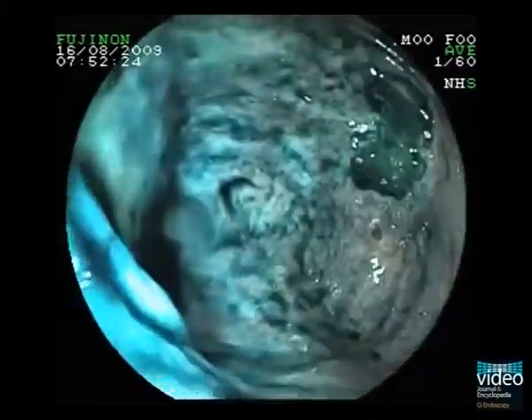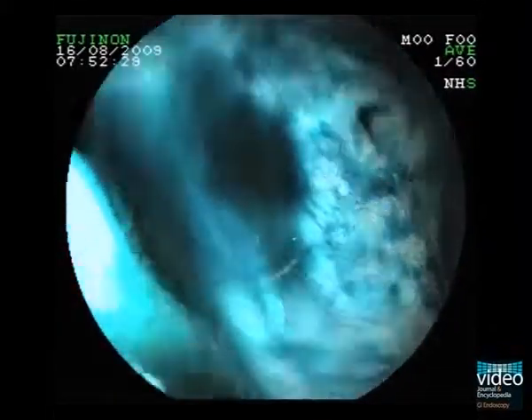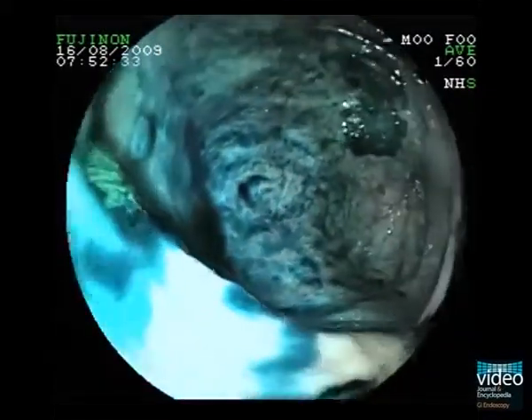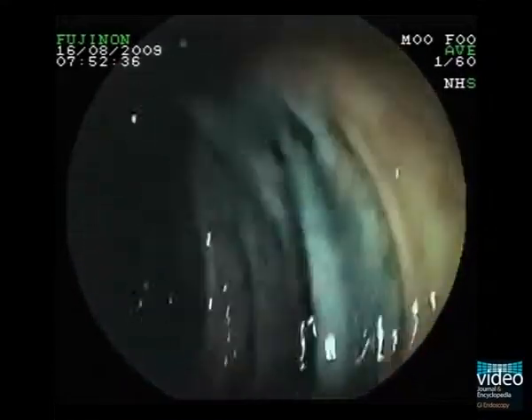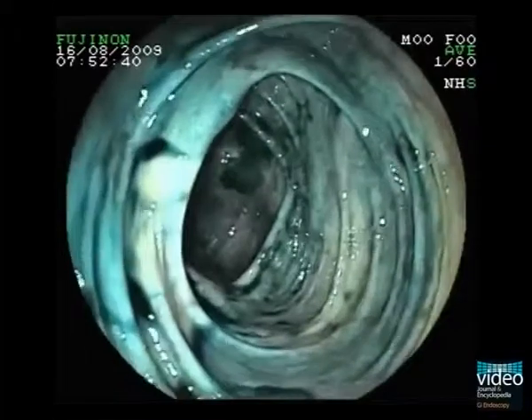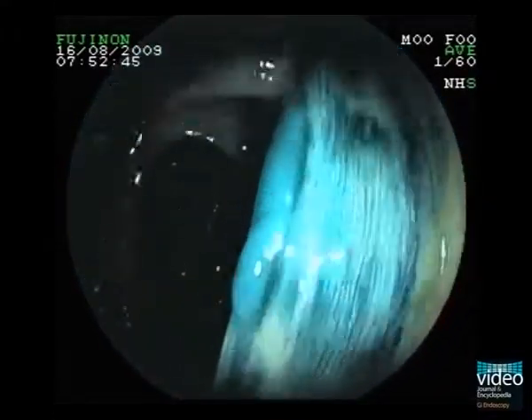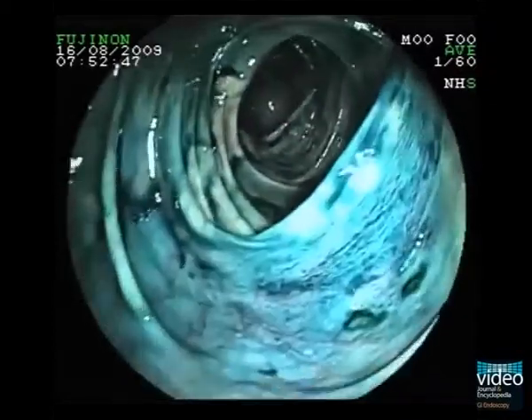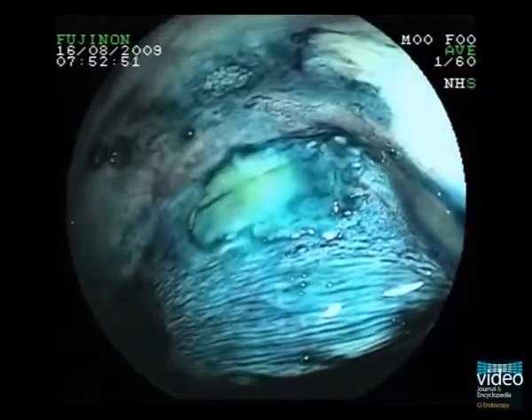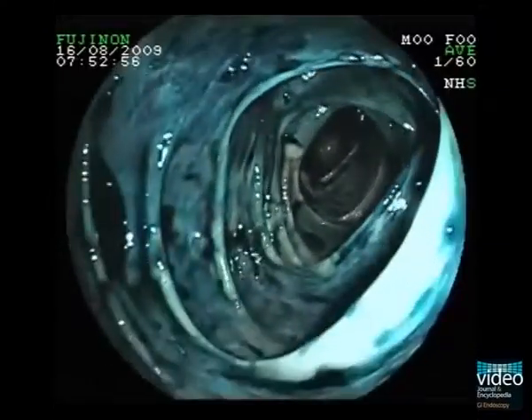Again, we withdraw the colonoscope and appreciate the additive findings we detect with chromoendoscopy. Look at this completely flat lesion within the level of the regular mucosa. According to the Paris classification, this phenotype is classified as 2B type.